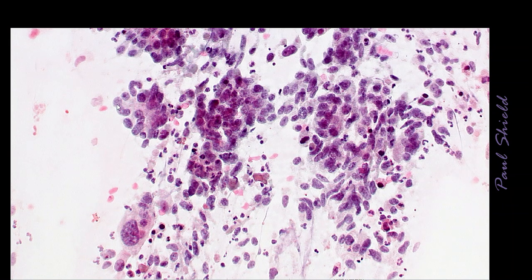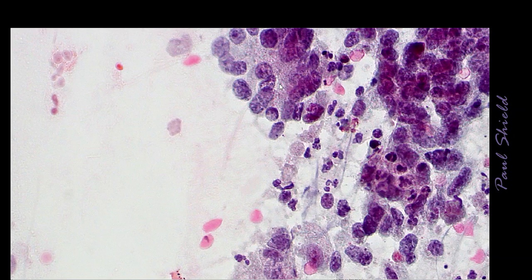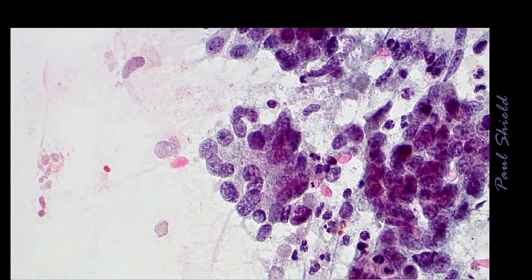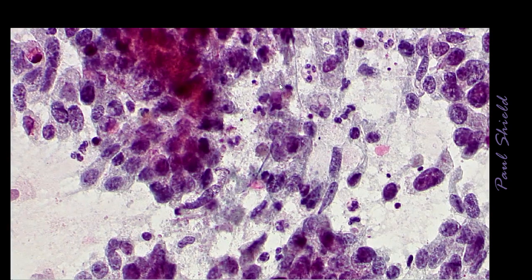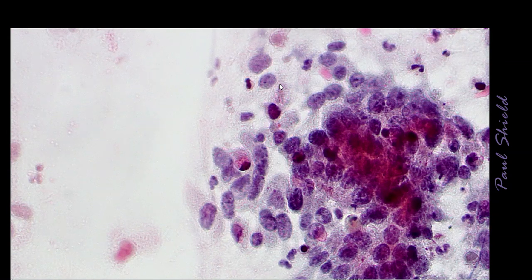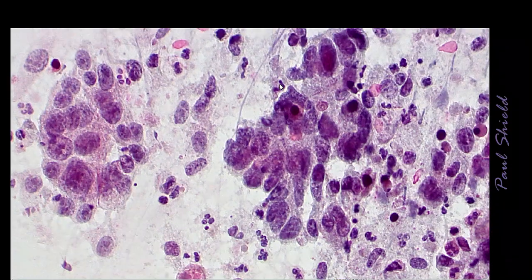You can see here an acinar arrangement of the cells, down here a huge nucleus. But there are bronch cells all over the place here too, so the tumour cells are kind of mixed up with that. We have more coarse chromatin here, granular cytoplasm, acinar arrangement there, and then you can see the columnar shapes in these cells as well. So not a huge amount of nuclear enlargement here, but very coarse, irregular chromatin.